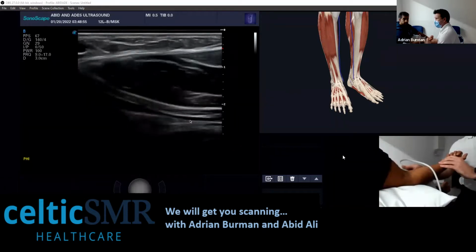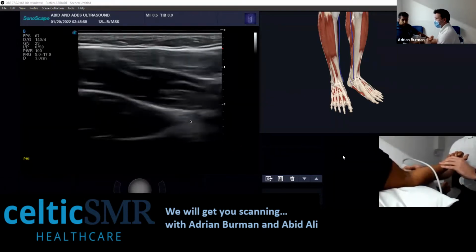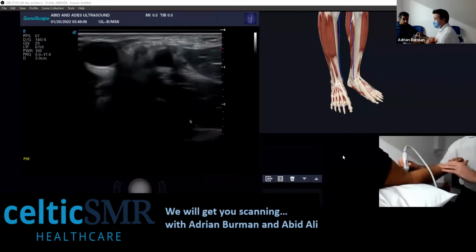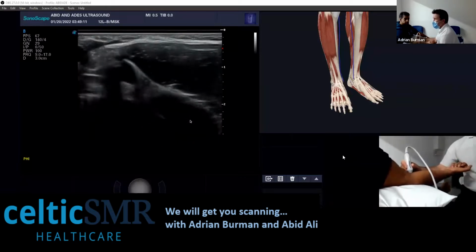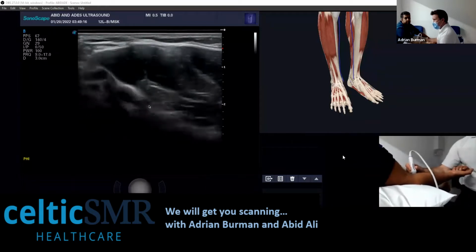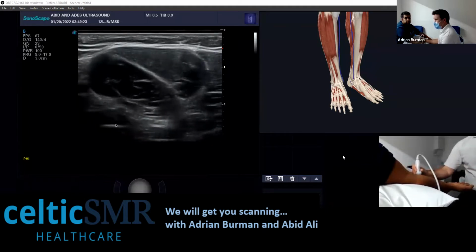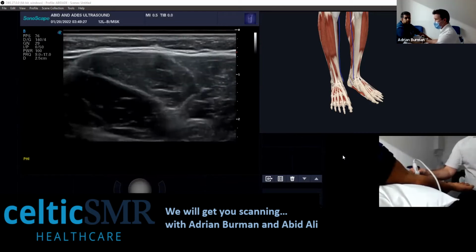Right there, and interrogate it. Yeah, that way onto the radial tuberosity. And what I found is if you follow the median nerve, which is here, and you follow it until it reaches the bottom here, and this is the tuberosity here. So therefore, I just rotate around that area and we give it the right depth.